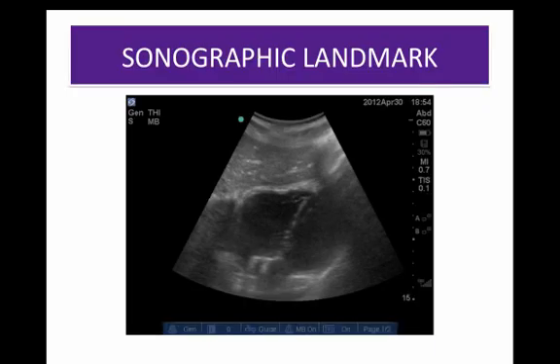The sonographic landmark is important as it is the identifiable structure that allows you to orient yourself to the relevant anatomy on the screen. And for all introductory applications, no image interpretation should begin until you identify the sonographic landmark. In this particular study, the sonographic landmark is the heart. And as mentioned previously, it should appear as the probe slides toward the xiphoid.